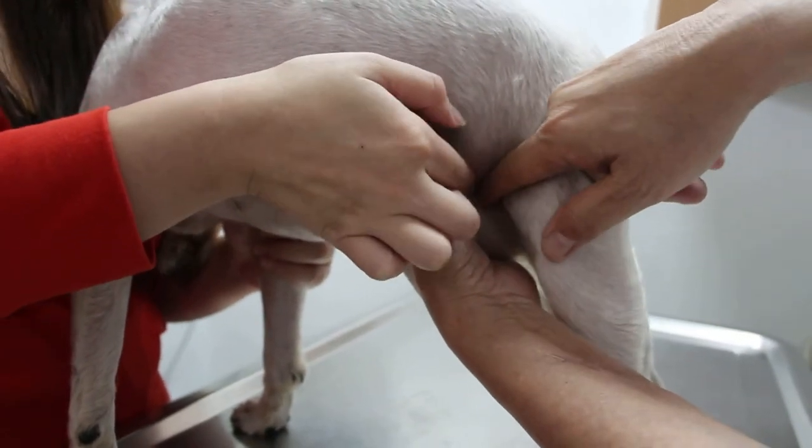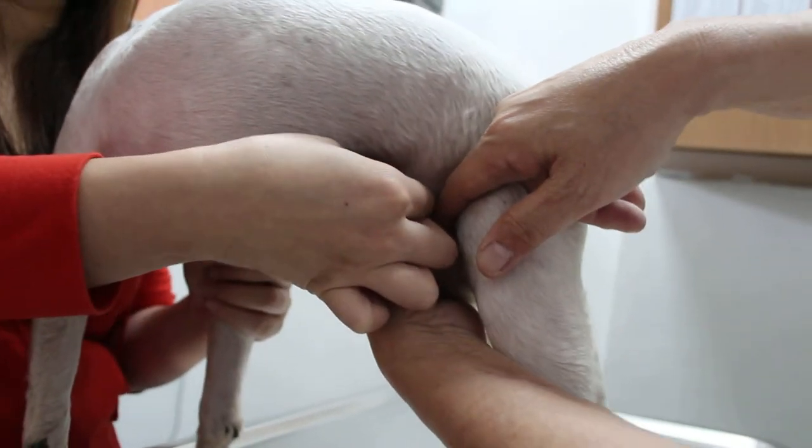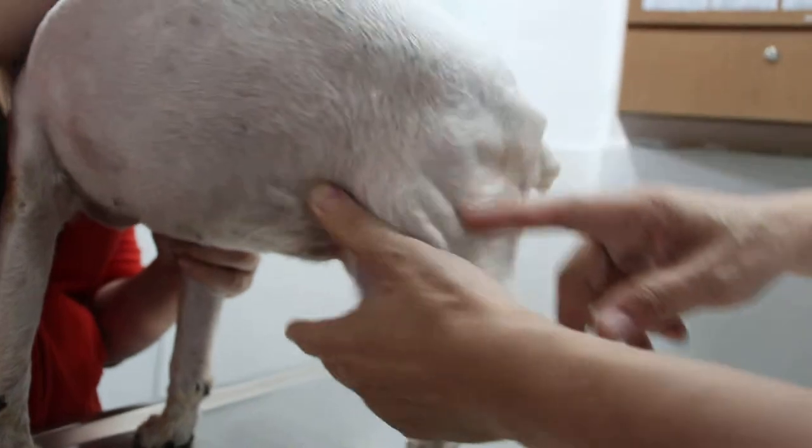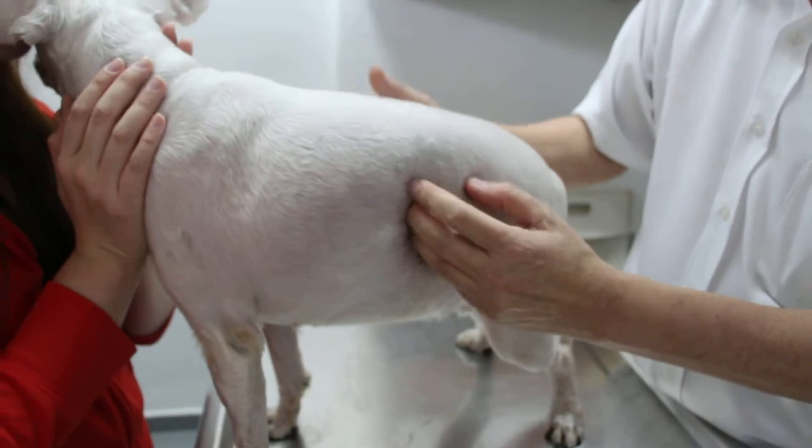It's probably not one stone. From one end to the other end it's more than 3cm. You can hear the click, click, click — the gritty sound. So in theory there's a lot of stones. What you want to x-ray is the bladder and the kidney.